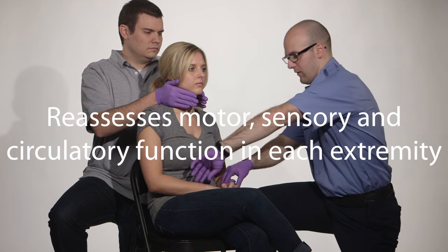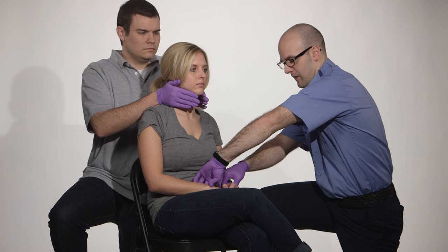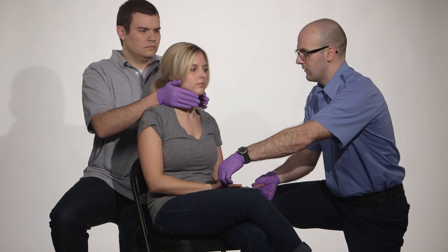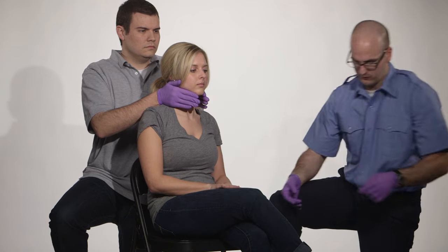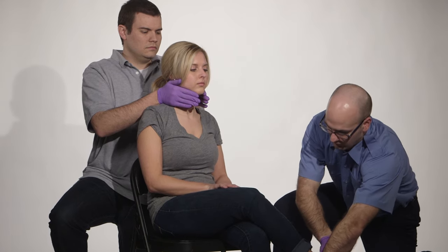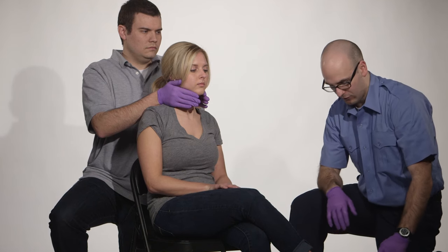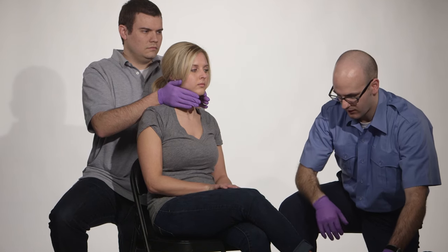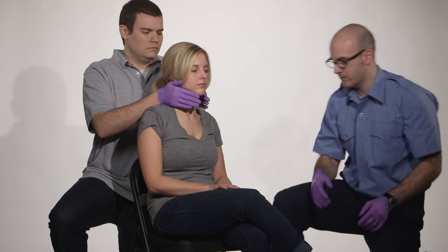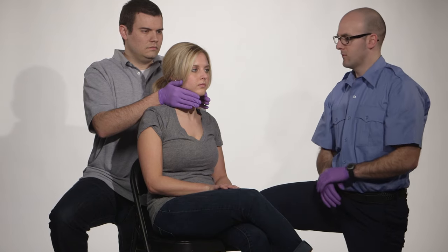I have pulses bilaterally. Can you move your fingers for me? Can you feel me touching you here? Then I'll do the feet. I will take the shoes off and then I will find pedal pulses. I have pulses. Can you wiggle your toes for me? And can you feel me touching you? You have pulses, sensation, and motor function in all extremities.